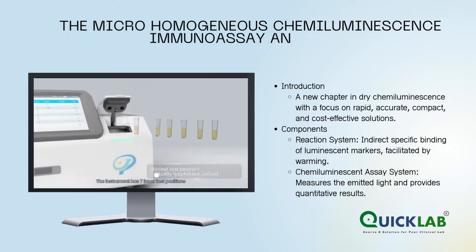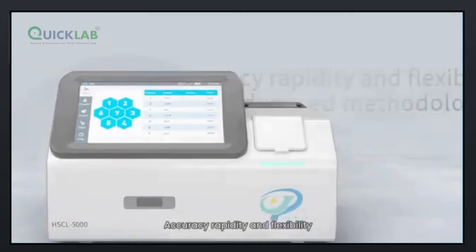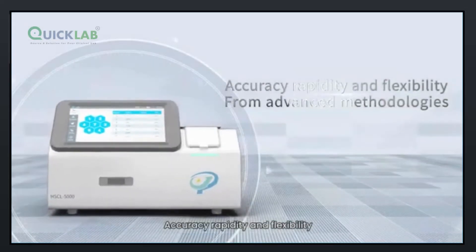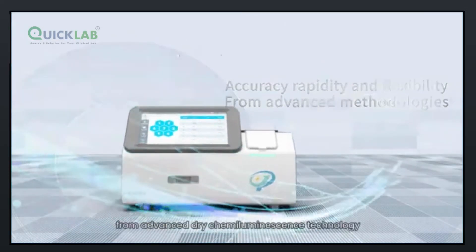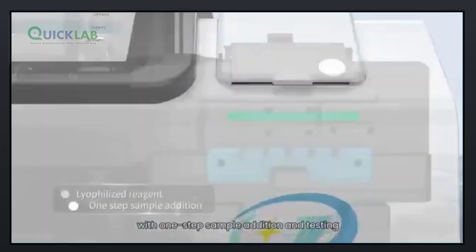To bring more reliable diagnostics to life, the instrument has seven inner test positions. Sample reporting features accuracy, rapidity, and flexibility, from advanced dry chemiluminescence technology, with one-step sample addition and testing.